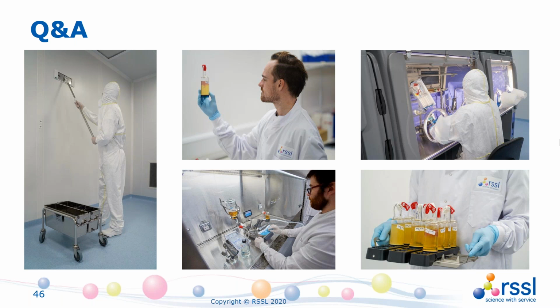Right, okay. And a question from Rachel, do you have any advice for subculturing turbid products in terms of the contamination risk? They are fiddly. The best thing is to go back into the, if you're fortunate to have an isolator to do the sterility test, or if you're not using the UDAF within the clean room, is to do all the activity back inside the sterility testing area.